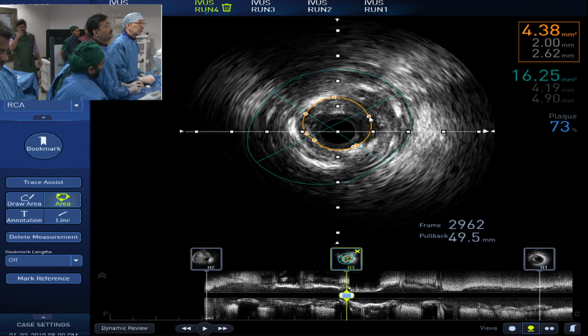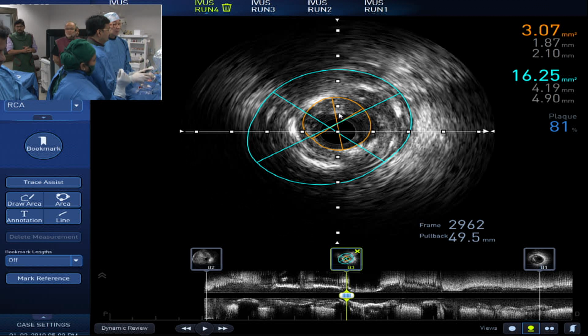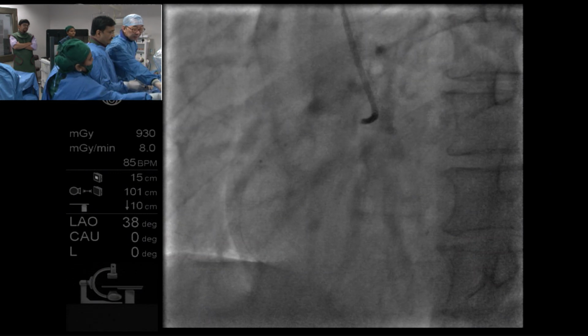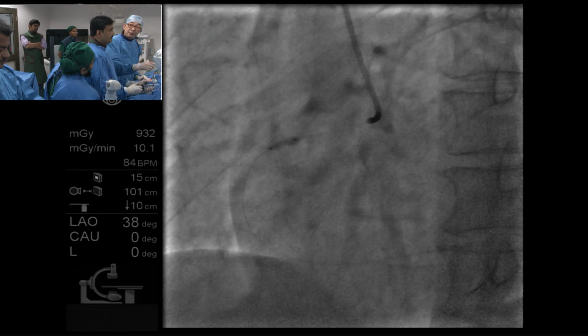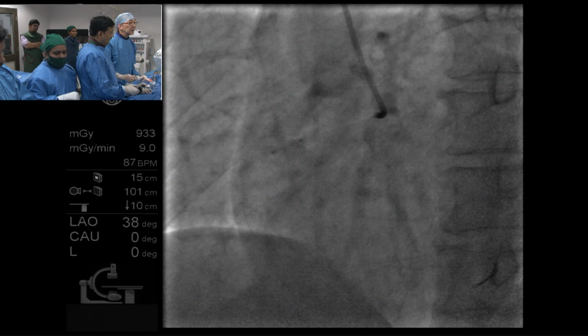Question for you, Mamas: when you do these lithotripsy cases, do you check the troponin post-procedure, and any debris embolus? We don't check troponin unless there is a complication. I think in this sort of case I would almost go to a cutting balloon or something.